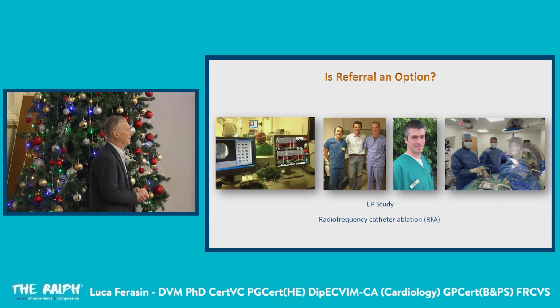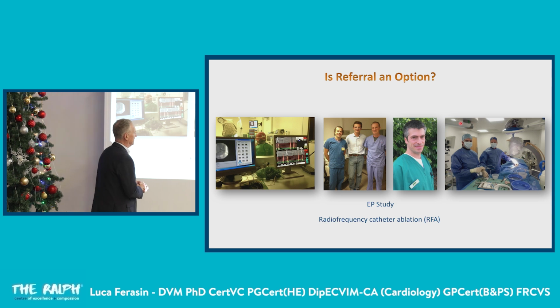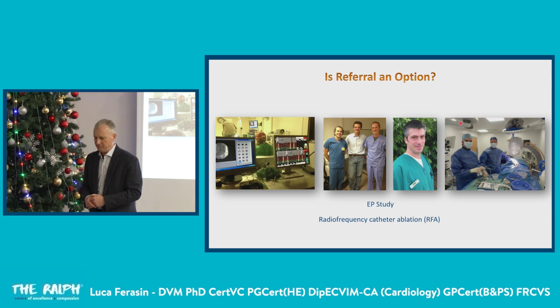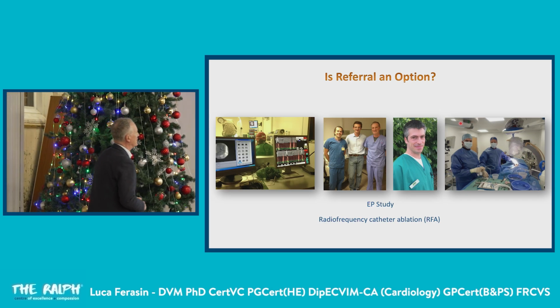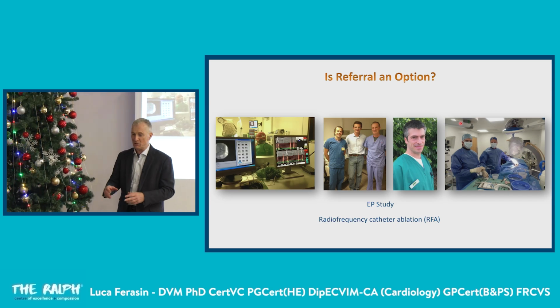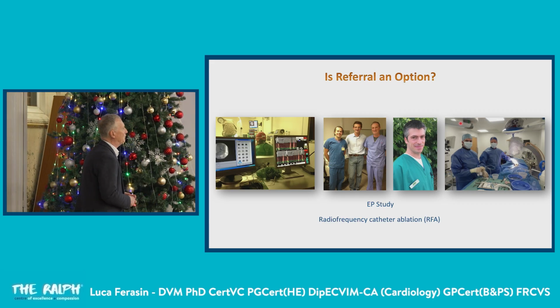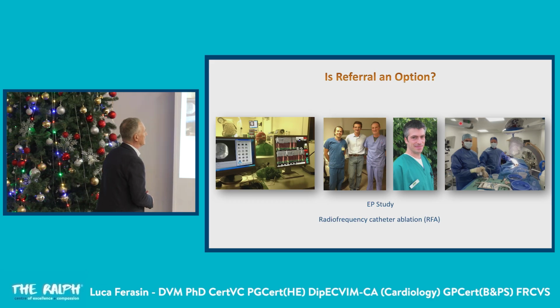This study has been around for many years now, and I think the pioneer in veterinary medicine is Roberto Santilli here. Sergio was one of his pupils, and I used to follow him when he was doing all these studies. That's what you see here on the screen during the procedure, because you got many, many channels to understand exactly where the abnormal bit, the abnormal cells are.